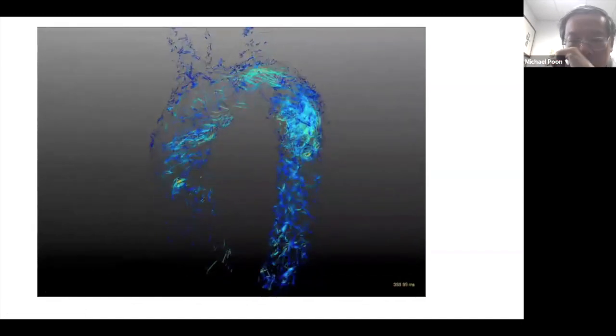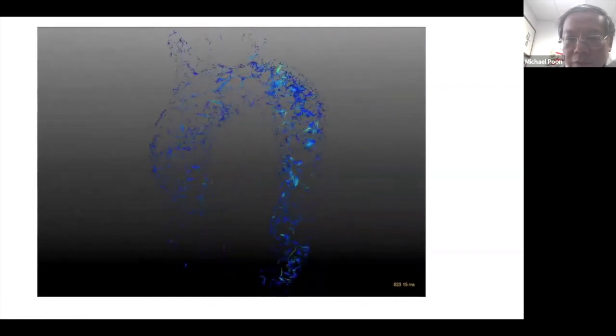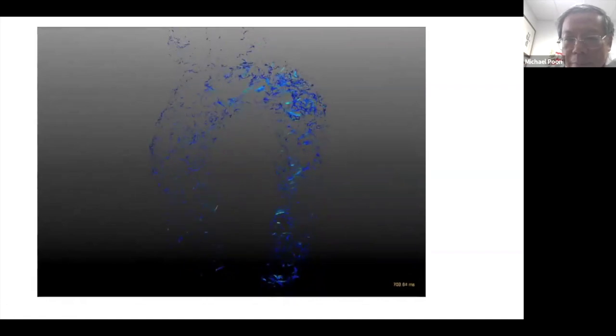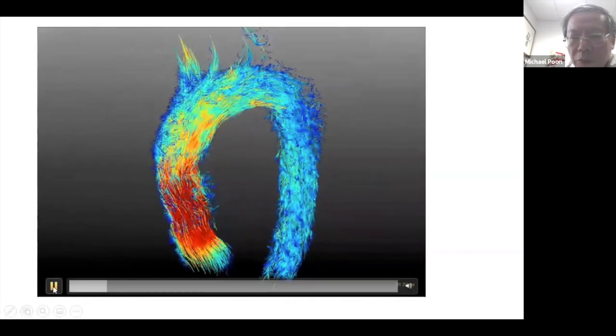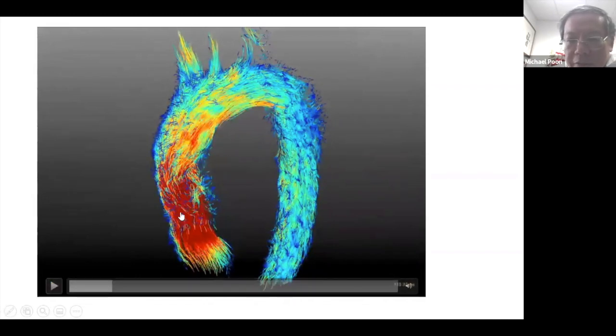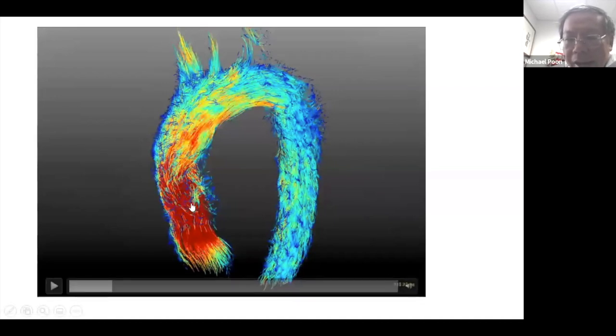And the flow is not normal if you have some valve problem, or if the blood vessel becomes very stiff from high blood pressure or high cholesterol. You will see the flow pattern to be very abnormal. You see the red color is very high velocity, and as the velocity slows down, it turns into other colors. So this is very useful to determine whether the velocity is dangerously high, and if it is, the patient would need to have valve surgery to fix the valve so the velocity does not become too high.